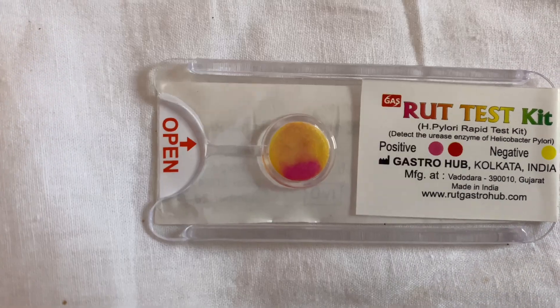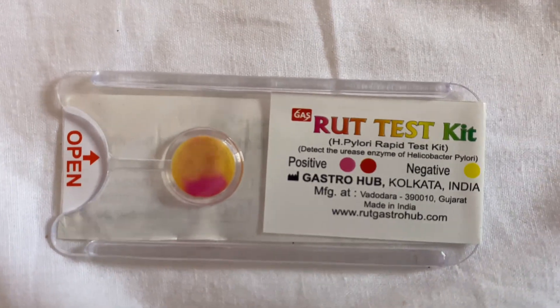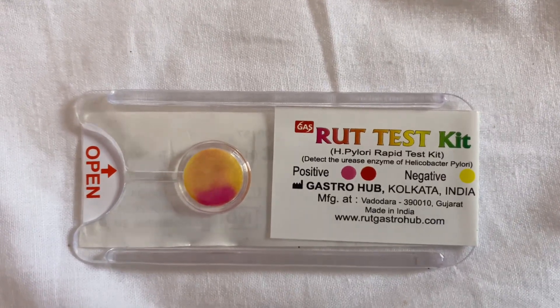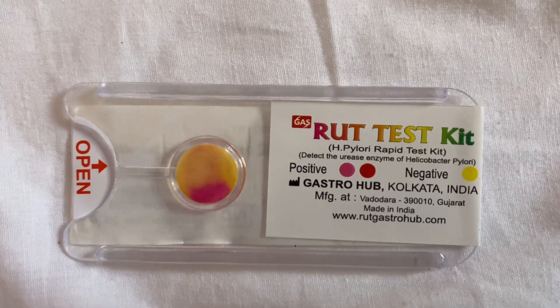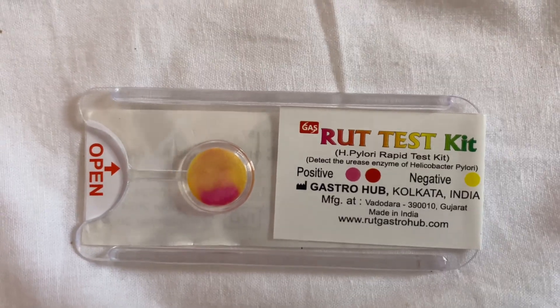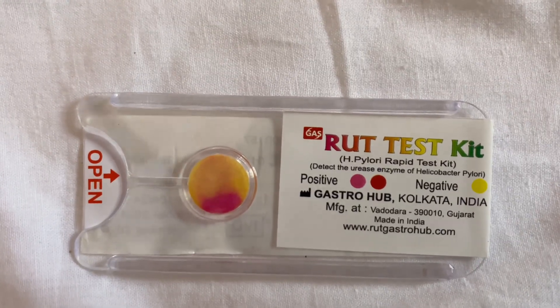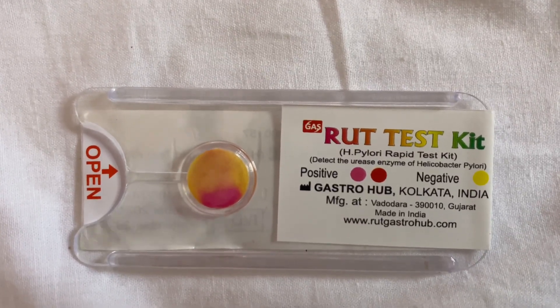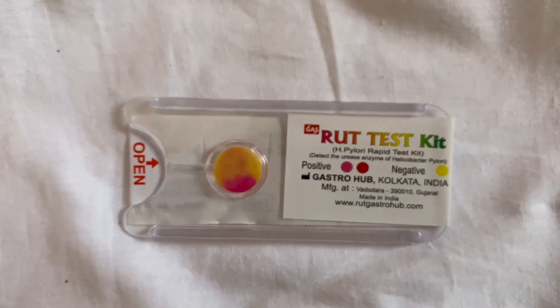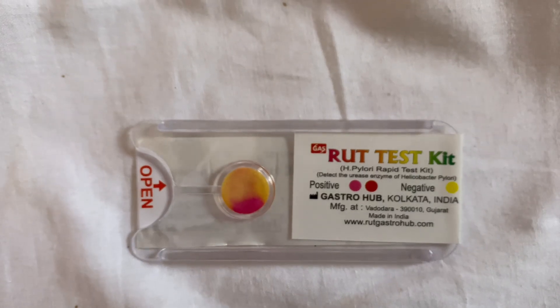A small piece of stomach tissue is placed on the kit and observed for a change in color. H. pylori organisms produce a large amount of an enzyme called urease. The RUT test kit detects the presence of urease in the given sample and changes its color to pink or red if urease is present. So it is an indirect method of recognizing the presence of urease, or the presence of H. pylori, in the given sample.